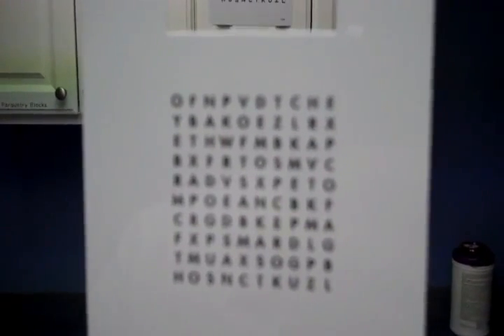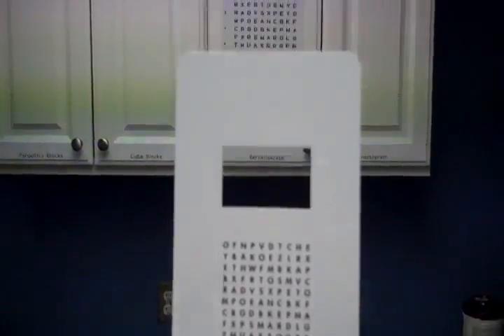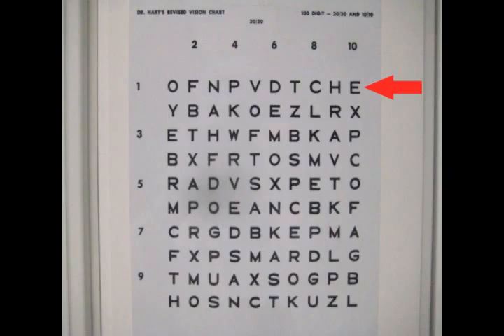Then slowly bring the handheld chart closer to your eyes until the letters become blurry. Hold the card still and try to clear the letters. Blinking is often helpful. If you are unable to clear the letters at that distance, return the handheld chart to Harmon's distance and clear the first line of letters on the distance heart chart.